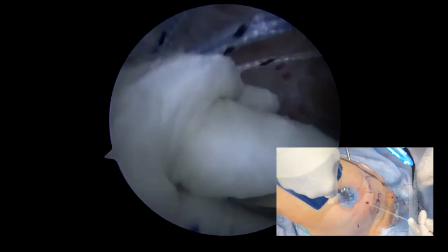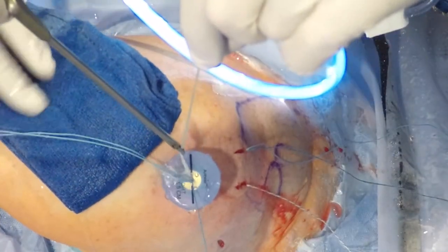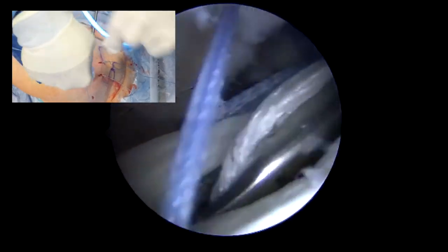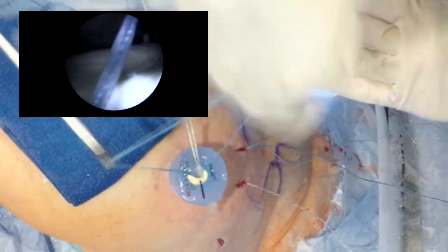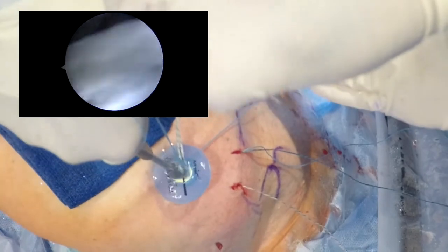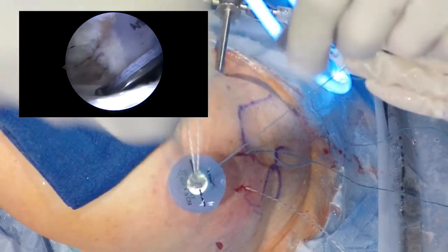As we pull on these sutures, they will tighten, so there's no need to tie knots here, which would be challenging in this particular scenario. Now we can also use a knot pusher to ensure that the graft is sitting on the superior glenoid and we've taken out the slack.